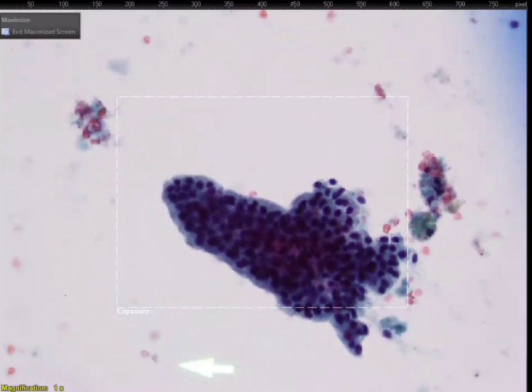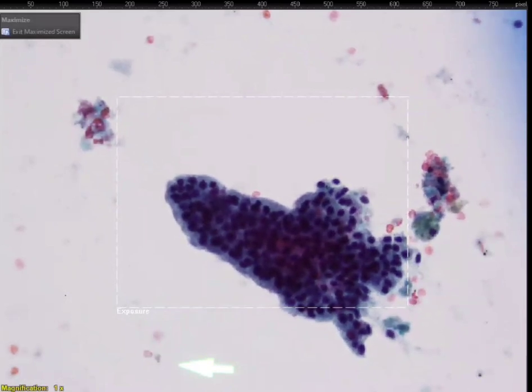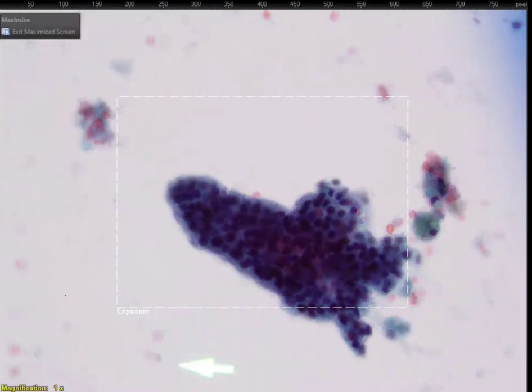This is quite thick, almost a papillae. Would reserve cells do this? Not usually. Are they little papillae of endobronchial, respiratory epithelium? We just saw some on the other slide, right?